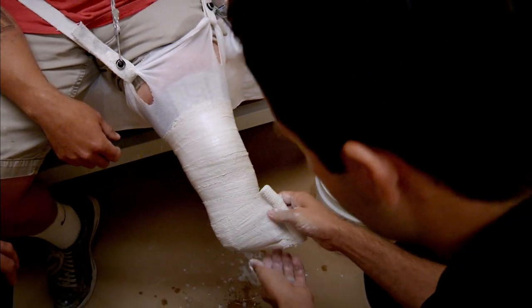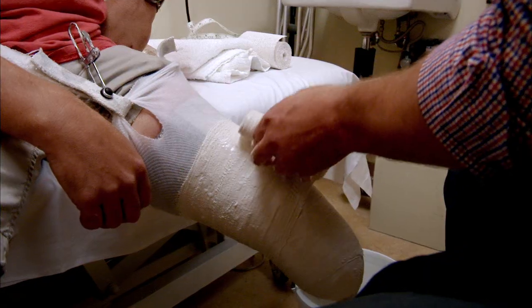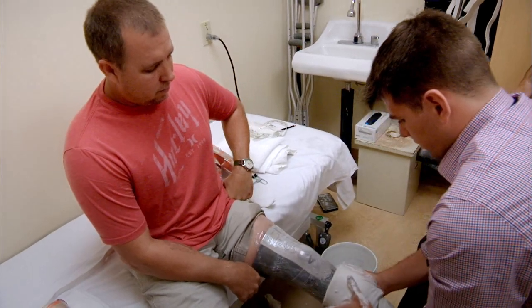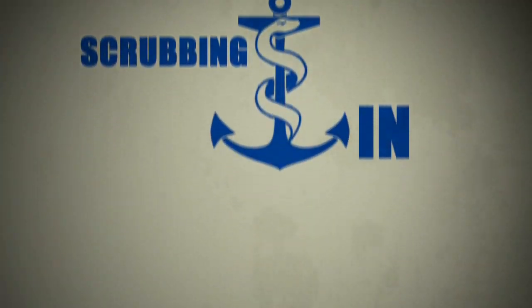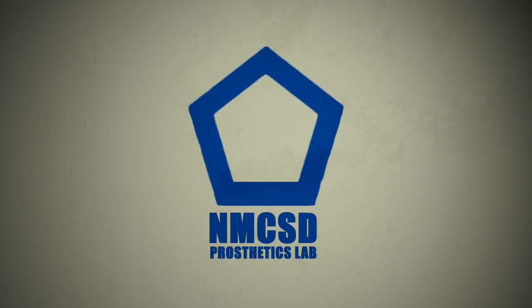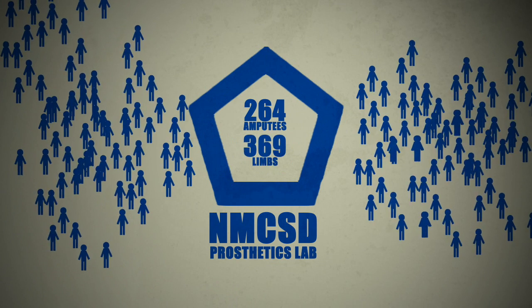Brian showed me the technique for making a cast and I applied it to Nate, who was a great sport. The prosthetics lab at Naval Medical Center San Diego treated 264 amputees last year with a combined 369 limbs lost. These amputees were made up of active duty service members, their families, and retirees.